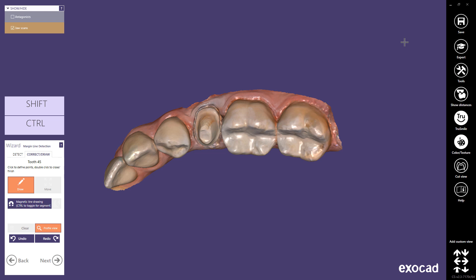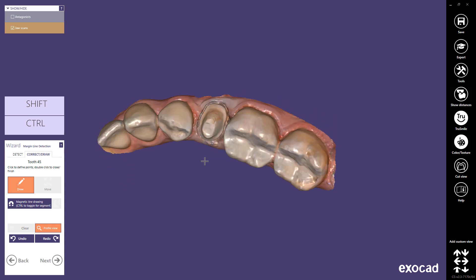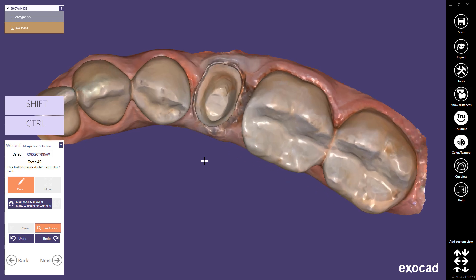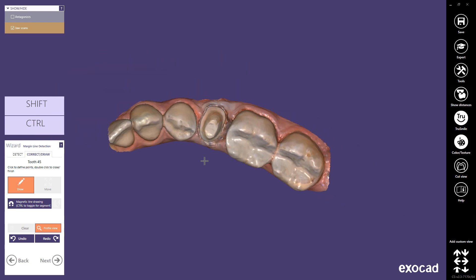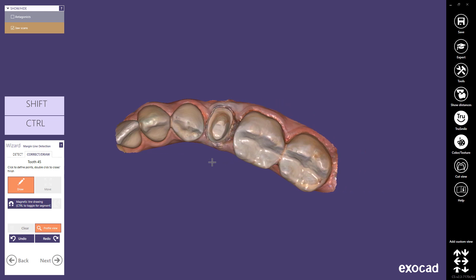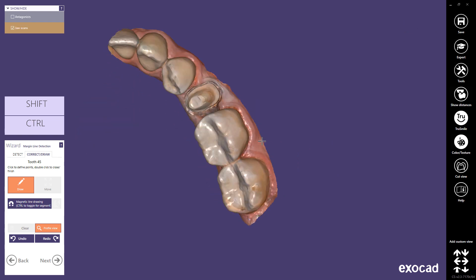You may navigate in 3D space using your mouse. Use the right mouse button — hold and drag — to rotate the view around the rotation centre. Use the mouse wheel to zoom in and zoom out. Using both mouse buttons, hold and drag to pan.